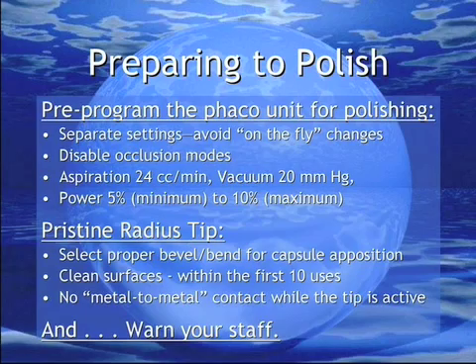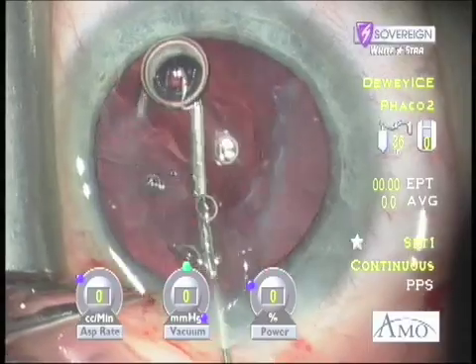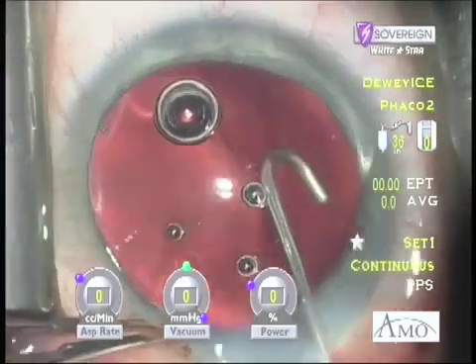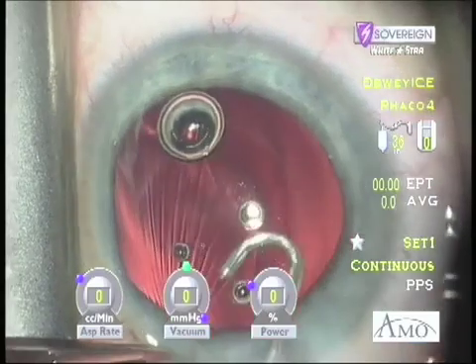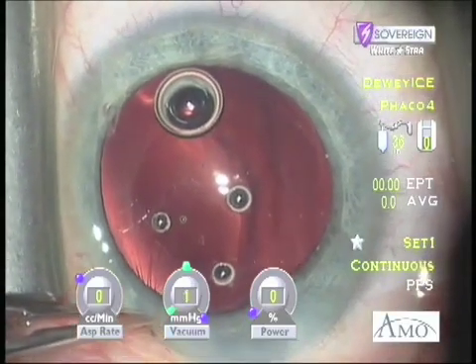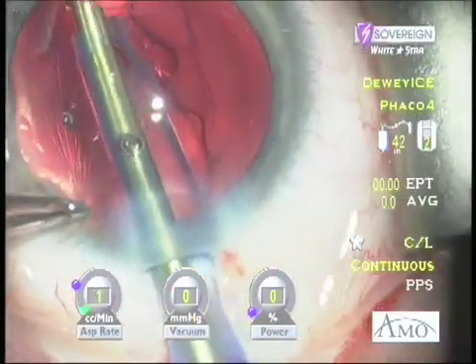The gut reaction can be fairly strong. In this example, the J-cannula is used to clear the cortex and improve visualization of the capsule. Polishing can be carried out without clearing the cortex; however, should the capsule break, managing the situation would be easier without residual cortex. Using the J-cannula avoids disconnecting and reconnecting the FACO handpiece. The FACO unit has been pre-programmed for very low levels of aspiration, vacuum, and power. The FACO needle is reinserted into the eye, beveled down, attempting to achieve occlusion with the capsule.